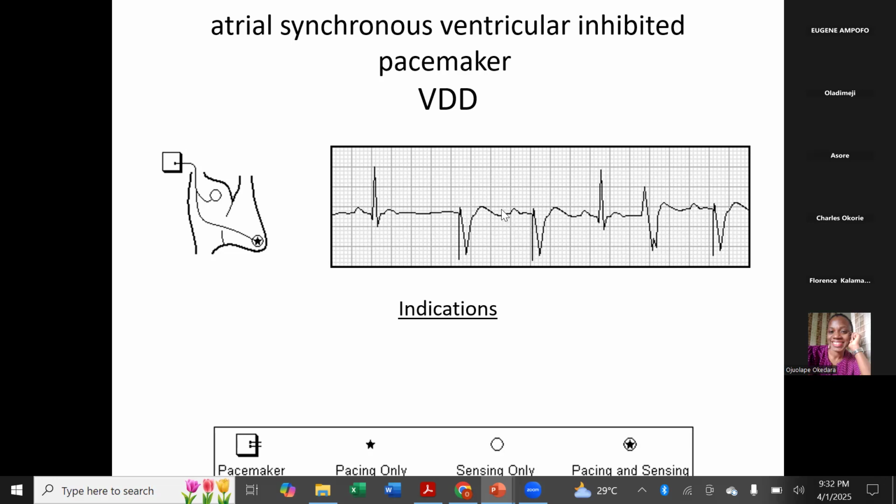Number 2 here is that it sensed atrial activity. Okay? It has a PR interval. So anytime, especially when the patient has a dual chamber pacemaker, or it has the ability to sense atrium and ventricle, it will give you the option to set a PR interval in your pacemaker programming. So you are the one that will choose, I want a PR interval of 180 milliseconds, 200 milliseconds. So if the PR interval is not getting beyond the time you set, it's going to pace again. So that means that this pacemaker has the ability to what? Sense the atrium, because it determined the PR interval.